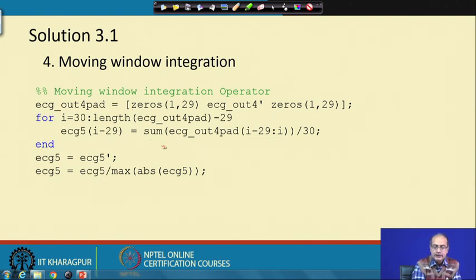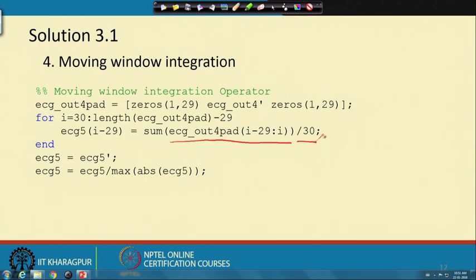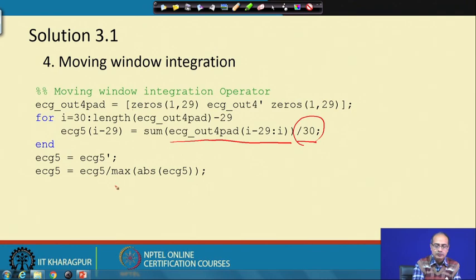Okay. So, we should take the last 30 points of the signal and do the averaging. So, it is divided by 30. Okay. In fact, for real time implementation you may avoid this point, because later on the scaling is done, it is not an offline operation. So, here we are doing the scaling. We could avoid this one, but we try to keep the form proposed by Pan-Tompkins.